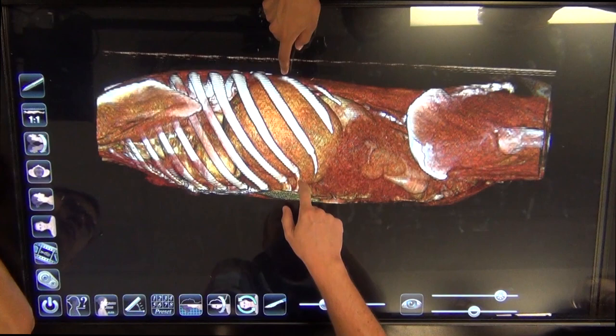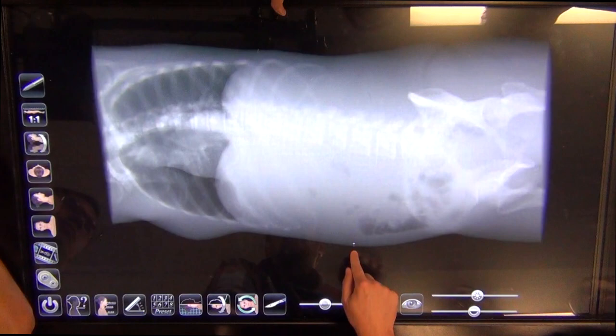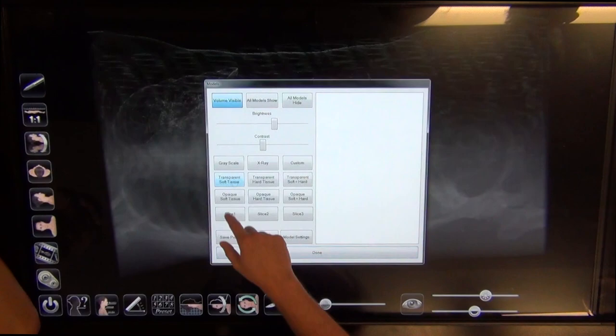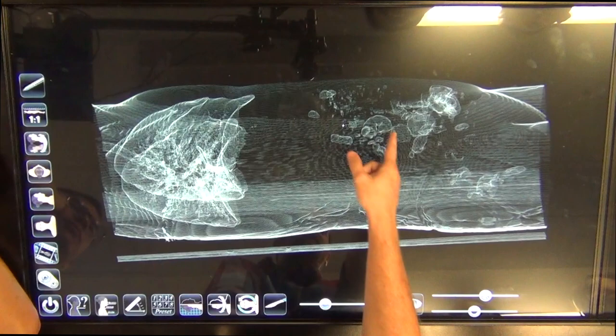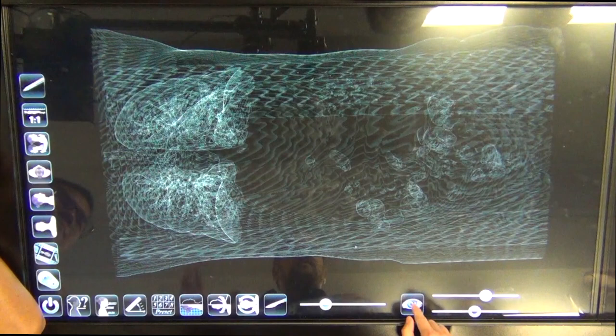So it's based on tissue density, and we can actually change the settings. We could look at it as a three-dimensional x-ray if we wanted to. This was a CT scan of an actual patient. You can also change it to look at soft tissue structure — this is good for airways. Sometimes there's contrast you can see in the abdominal cavity with the GI tract. You can also look at the actual slice data — with three fingers you can slide up and down through any of these scans, which allows us to go back pretty quickly and review.